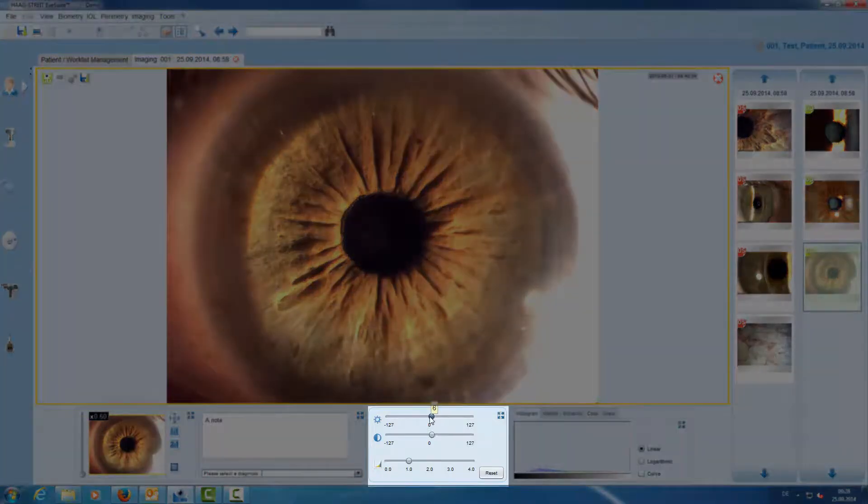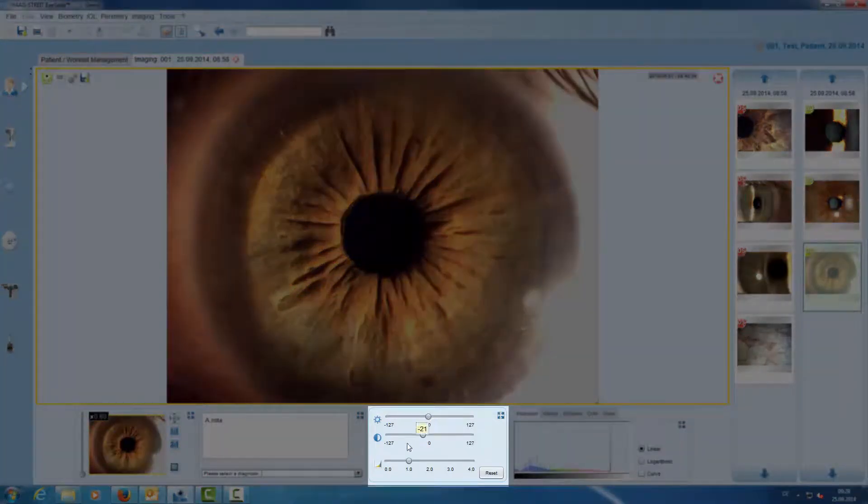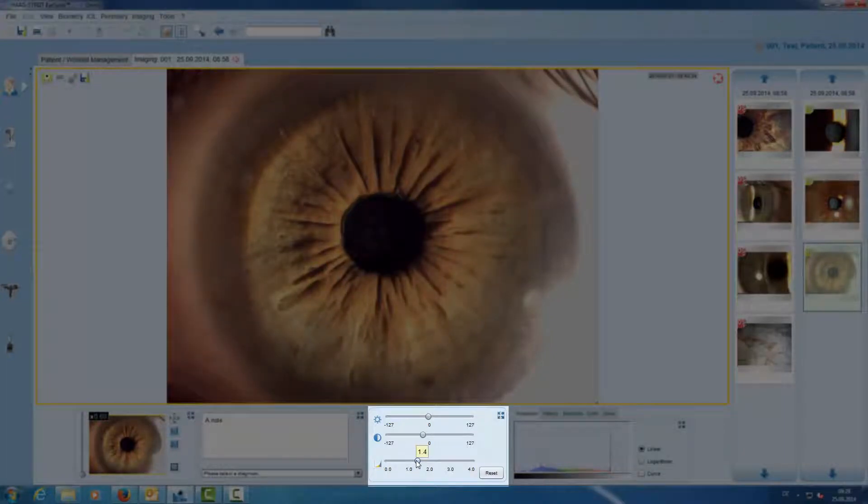Here we have the intensity tool where we can adjust brightness, contrast, and gamma values.